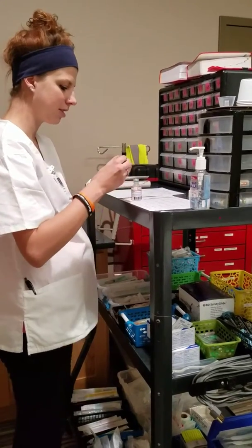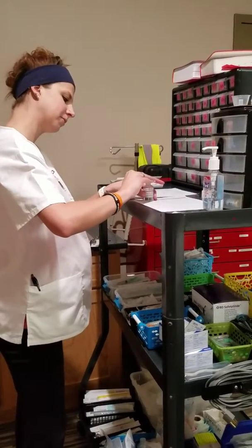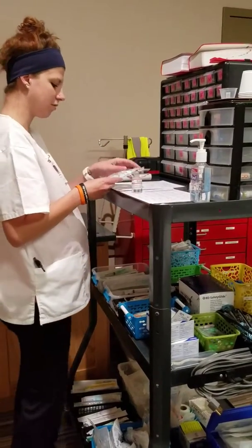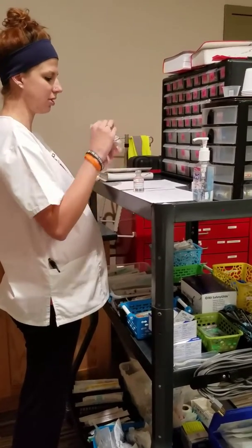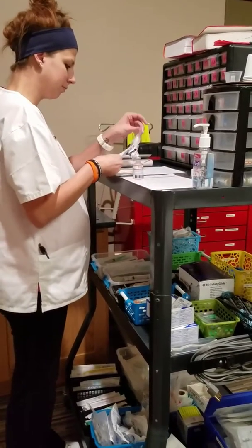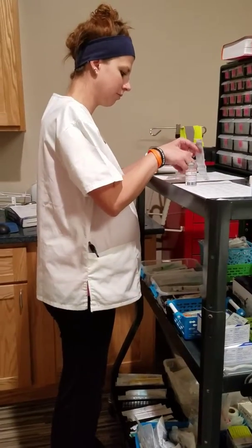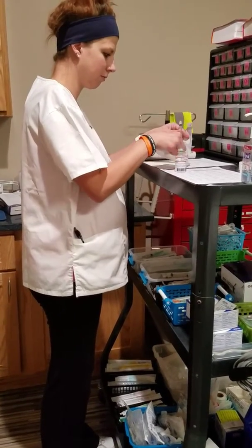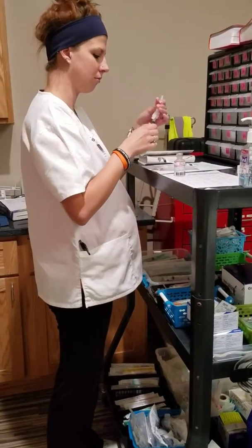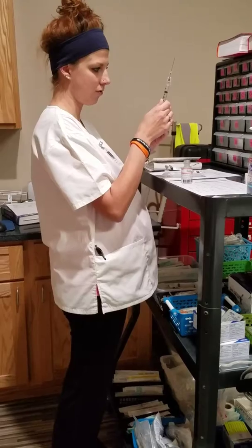The next thing we can do now is clean the top for 10 seconds. We want to make sure we have the proper syringe. This is a 3 ml syringe. It's a large needle for the intramuscular injection. And we're going to want to measure up 1 ml, which is right here.